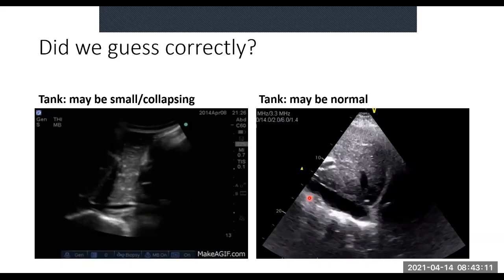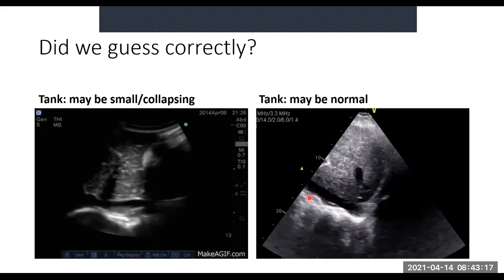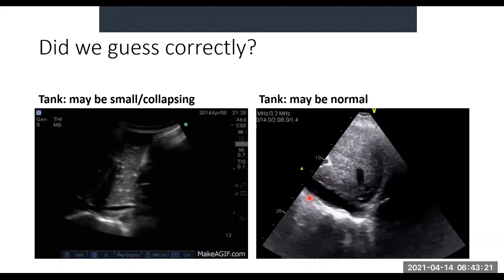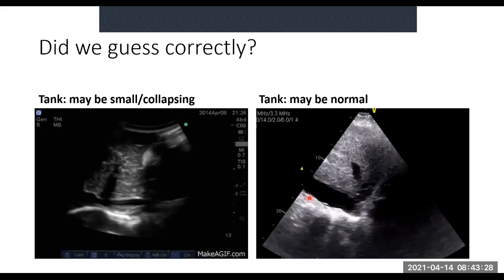Mottling of the skin, slow capillary flow, poor urinary output, things like that, right? These are things that would lead you to a diagnosis of septic shock. But this is what we'd expect to find on ultrasound.